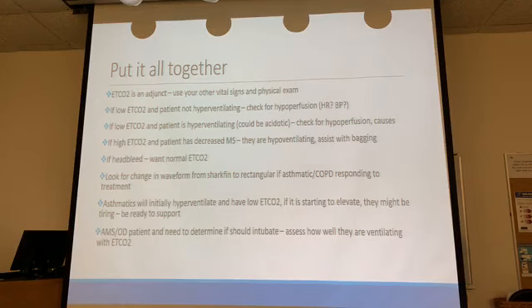On your altered mental status, overdose patients, it'll help you determine if you need to intubate them or get aggressive with the airway or not. See how well they're ventilating with their end-tidal CO2. If their end-tidal CO2 is staying normal, their O2 sats are staying normal, okay, I think I could probably watch them. You start seeing their O2 sats drop, that's one thing. If you start seeing their end-tidal CO2 starting to go up, that means they're not breathing enough. You need to probably start assisting them with a little bagging, help them get full deep breaths.